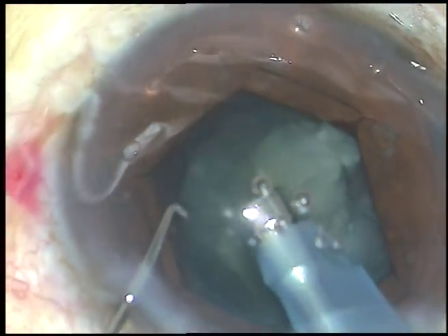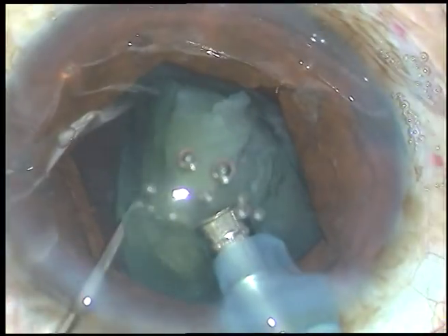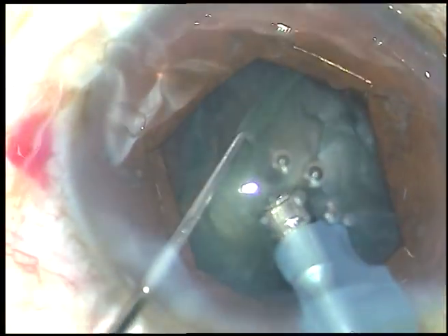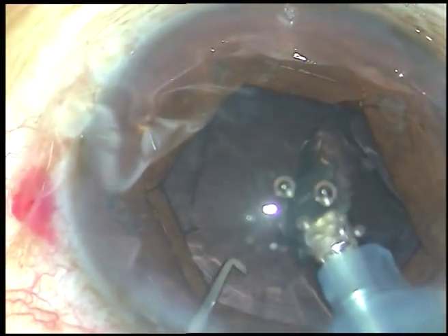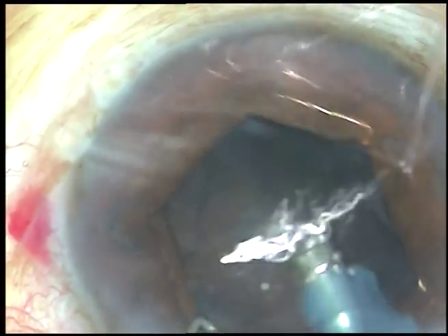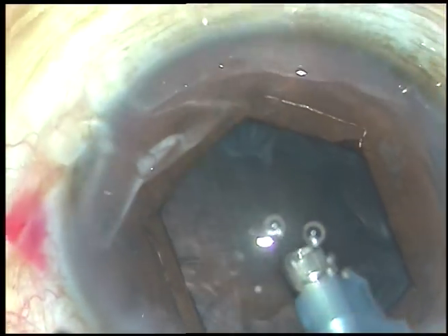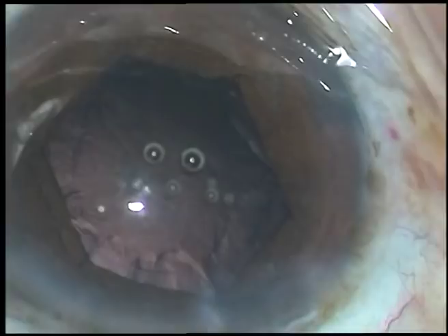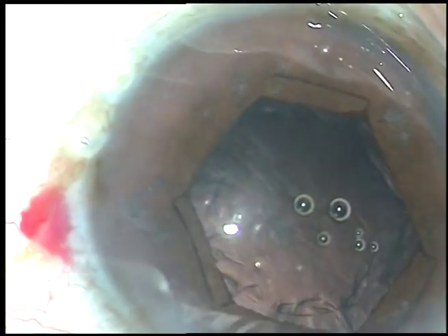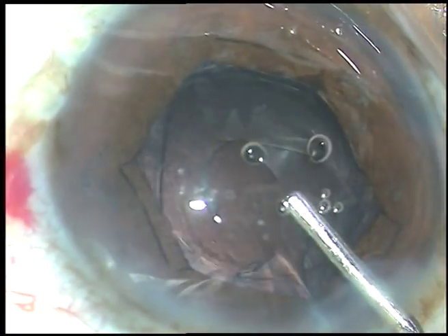This is the last nuclear fragment. Phaco energy used in this case is 55%. Flow rate is 40 ml per minute and vacuum is 400 mmHg. See the patient is constantly moving his eye in spite of repeated instruction.